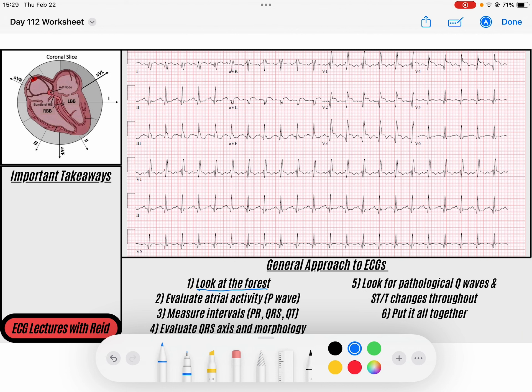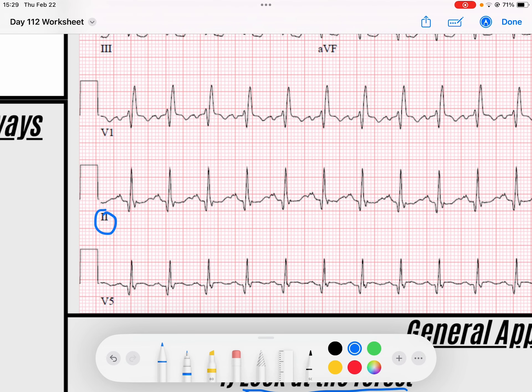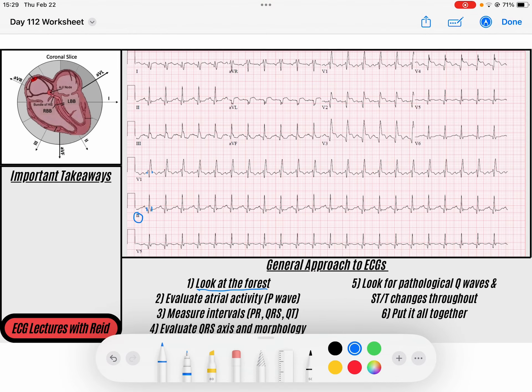First thing we're going to do is look at the forest, and the trees of the forest are my QRS complexes. Coming down to lead II, the QRS seems a little funky. If I zoom in really close, maybe it's a little bit on the wide side. And if you come to V1, you can see it a little bit better. So we've got a wide complex rhythm, and that wide complex rhythm is fast — it appears to be quite fast, and it's a regular fast the entire time.